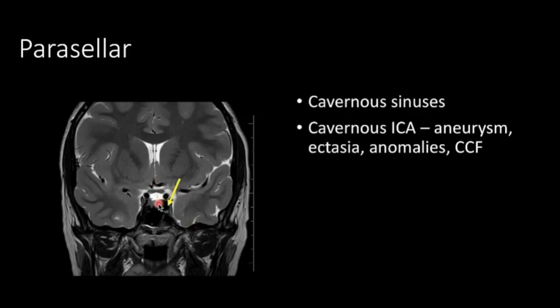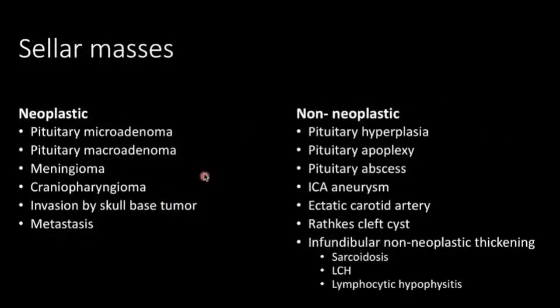Lateral to the sella is the parasellar region, where we see the cavernous sinuses and the flow void of the cavernous ICA. For example, if the left cavernous ICA flow void is markedly enlarged compared to the right, the differentials of aneurysm, ectasia of the ICA, or carotico-cavernous fistula should be considered.